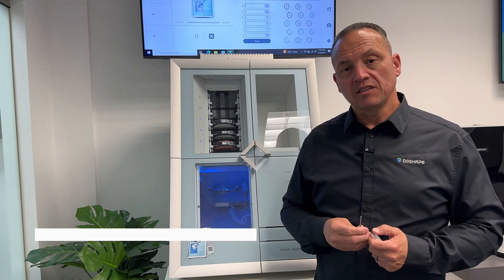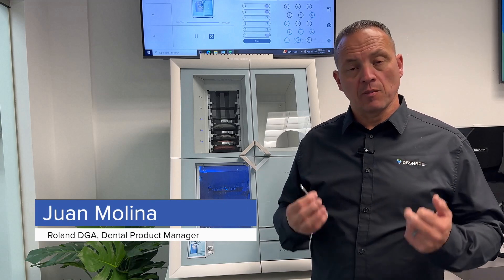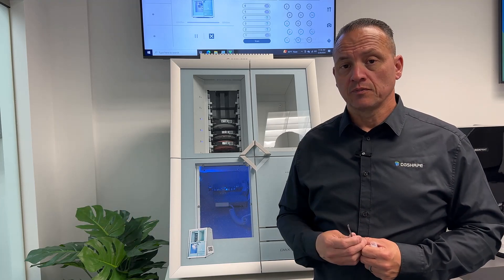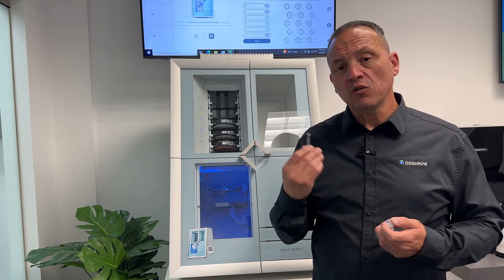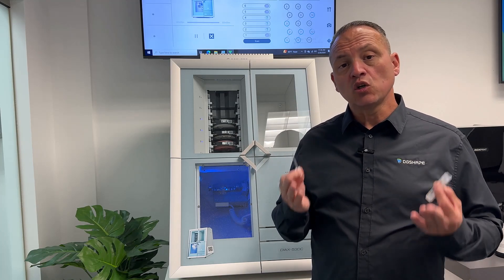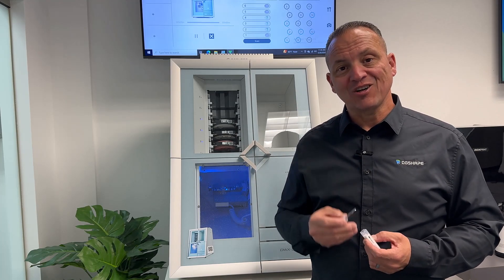Hi, I'm Juan Molina, DGSHAPE Dental Product Manager for the Americas. Today I have Ian O'Neill with me, Regional Sales Manager for the East Coast. He will be discussing a few topics regarding our 4mm burr, the RSB200D US. Let's get started.